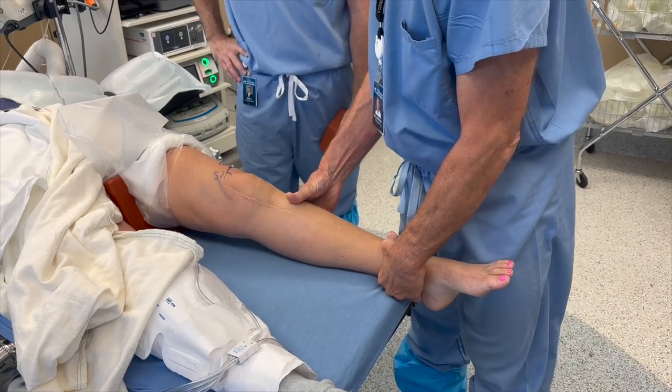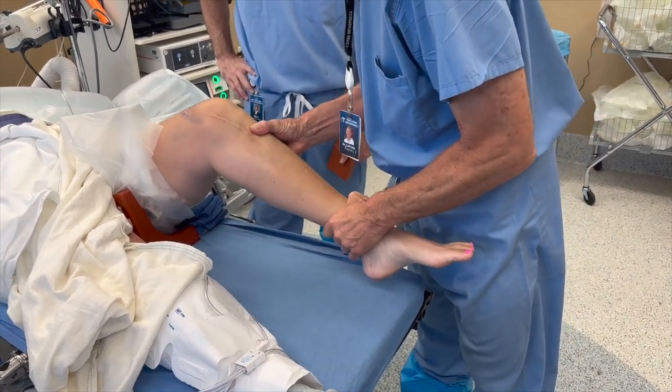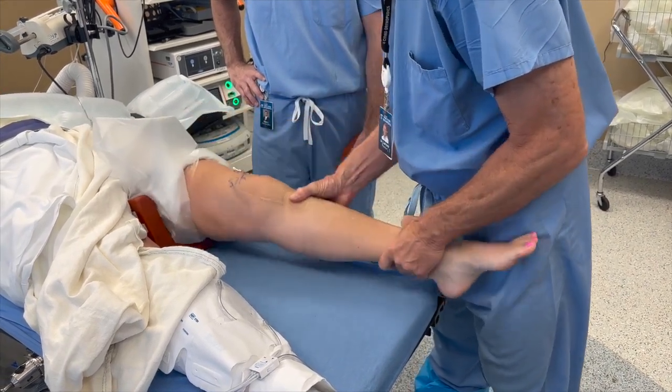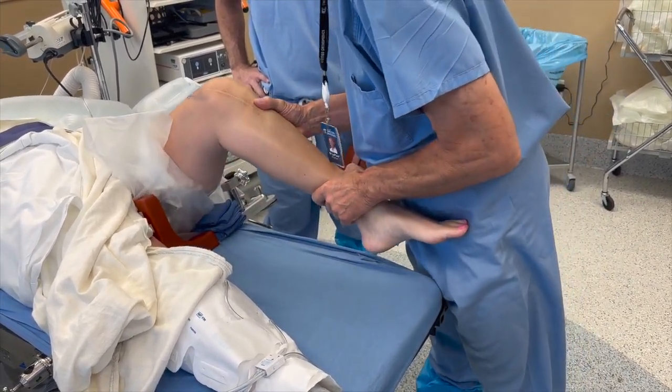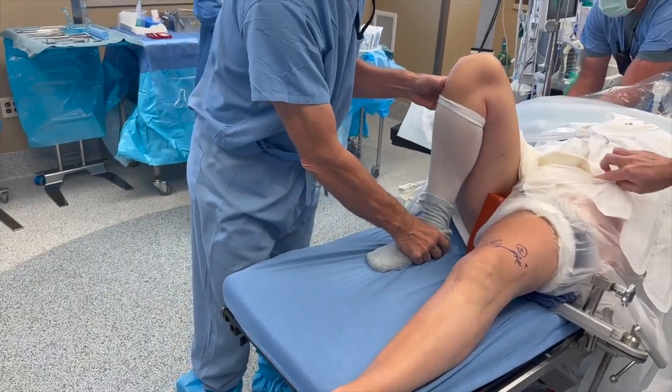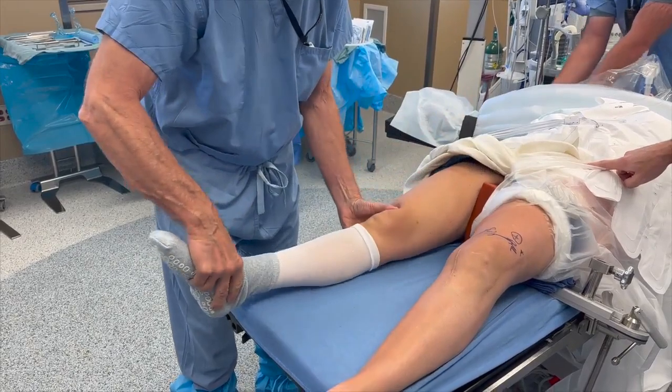The patient is placed in the supine position on the operating table. Following induction under general anesthesia, a bilateral knee exam is performed to validate clinical findings. This patient has left knee flexion up to 70 degrees compared to 140 degrees of flexion on the right.